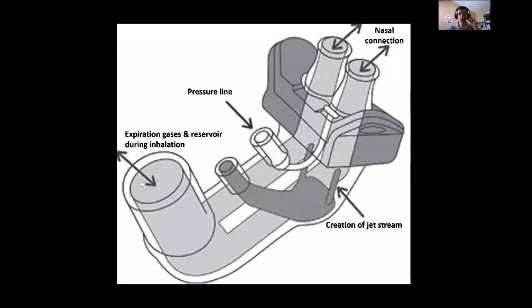The fluidic flow principle is fluidically moving the air away from the machine during breathing out. The flow goes through the exhalatory valve during expiration and goes to the patient during inspiration. And it's controlled by this jet stream. So flow in, flow out, flow in, flow out. And that's what we call a generator. And it differentiates between continuous and variable flow CPAP.